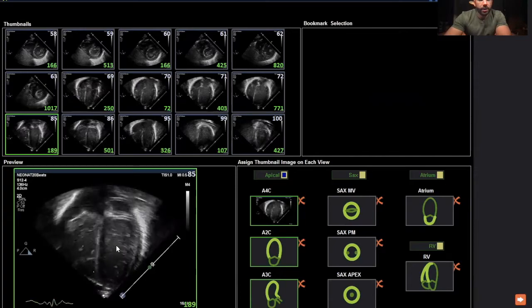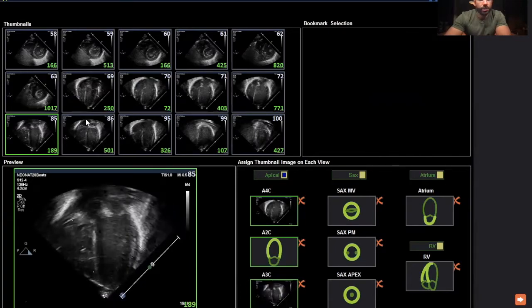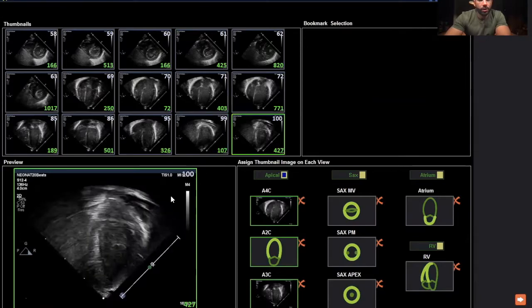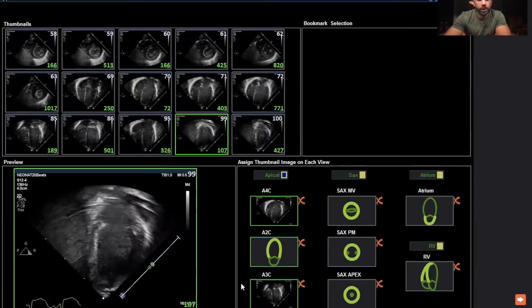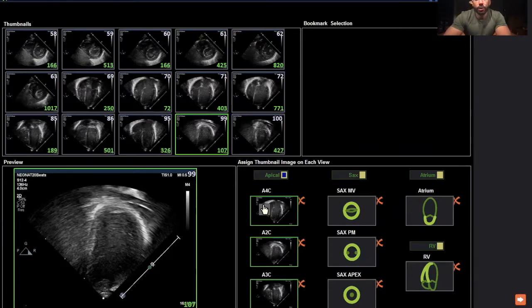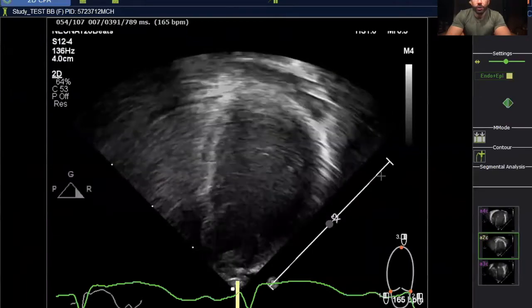I'll use this one for the apical three-chamber view, and this one for the two-chamber view. If you only have one view, you can do what we call a peak longitudinal strain, which is not global strain — it doesn't look at all walls of the LV. Typically in some studies we may use only the apical four-chamber view and do peak longitudinal strain in that plane. But since we have all three views, we will use them together.